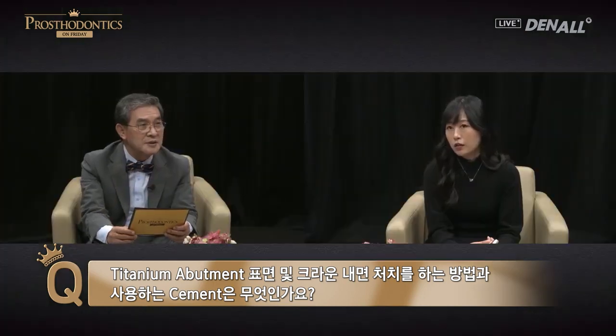More than light curing, you recommended self-adhesive. Light curing is okay, but in general, dual curing resin cement is used. For marginal area, tack cure is done ahead, and after that, excess cement is removed, and then do self-adhesive curing. If retention is additionally necessary, conduct a surface treatment both on titanium abutment and zirconia restoration.